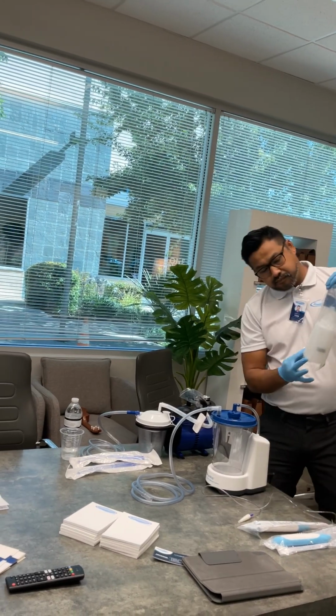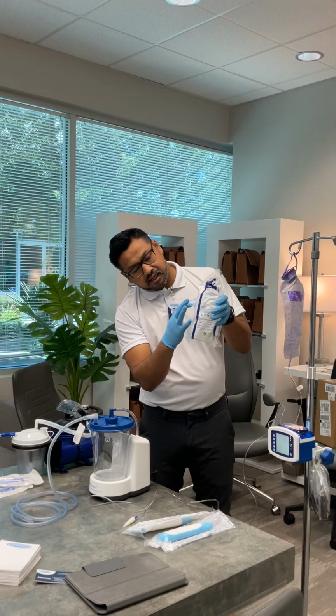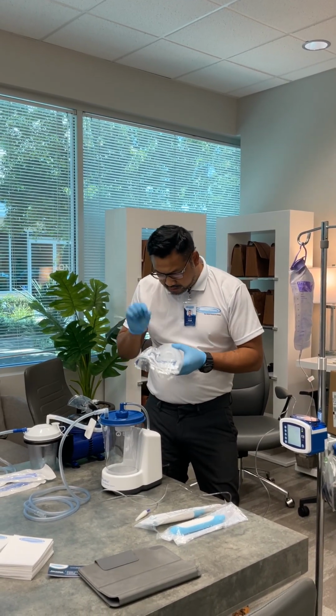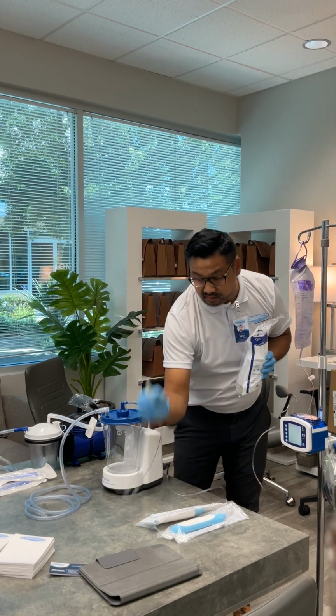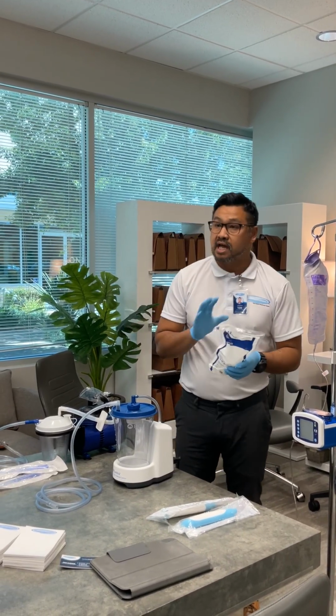This is the measuring container right here. There are little tick marks that show how many milliliters per container. There's a syringe right here, and there's also a little small adapter that reduces down to this size in here. So if you guys need these for water flushes, we have these as well.